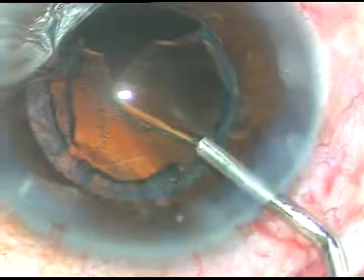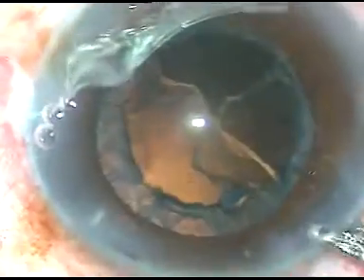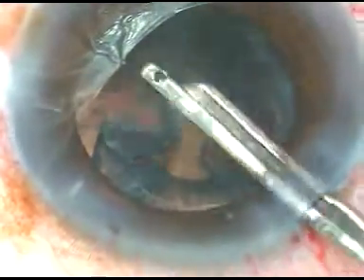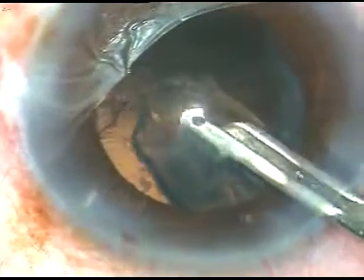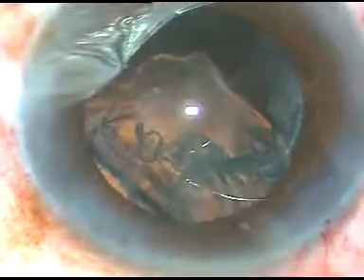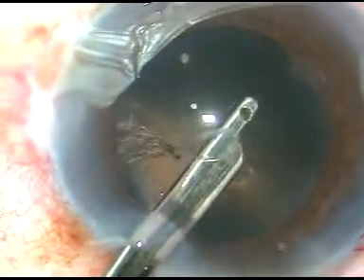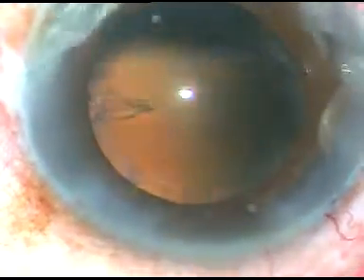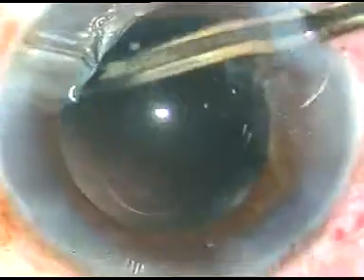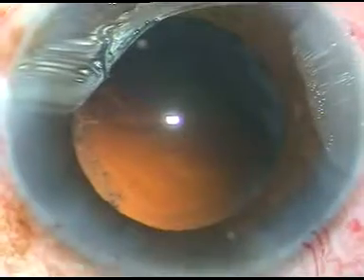A lot of cortical matter is there in this case and we have to clean it thoroughly. I am using a 23-gauge Simcoe cannula attached to a 10 cc glass syringe to remove this cortical matter. I go through the side port to remove the cortical matter on the other side. Now, at 3 o'clock there is some cortical matter which is being removed, and some additional cortical matter needs to be irrigated.